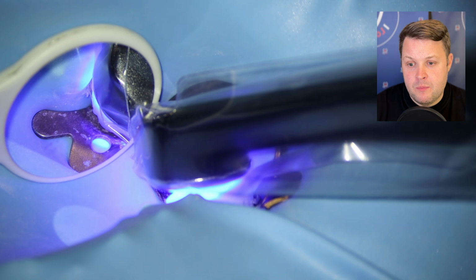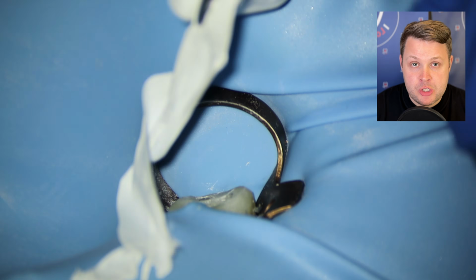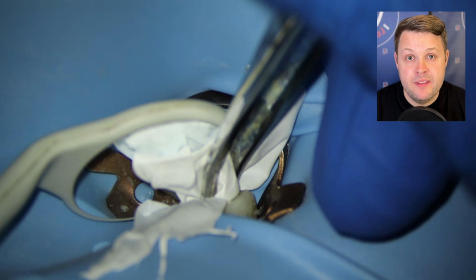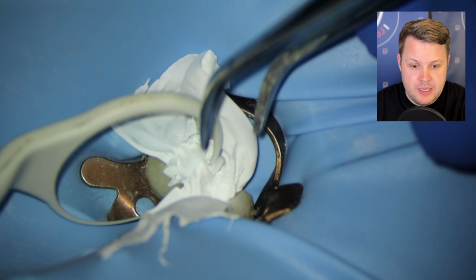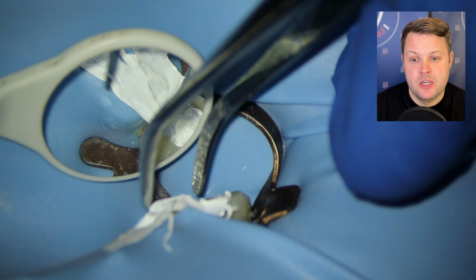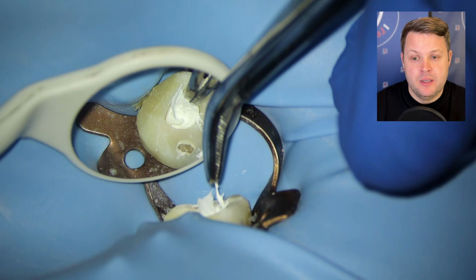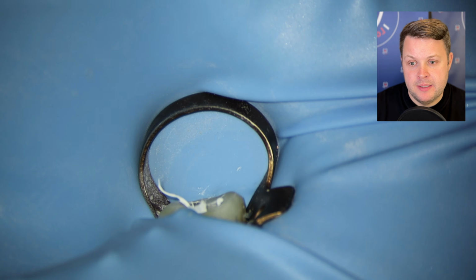Then I'm going to fill this with PTFE and GIC. And of course, the temporary's been cemented on with glass ionomer. I think it'll be easier for the referring dentist for me not to place a core in this tooth, and just to remove the temporary and then place a core and do the crown prep in one.